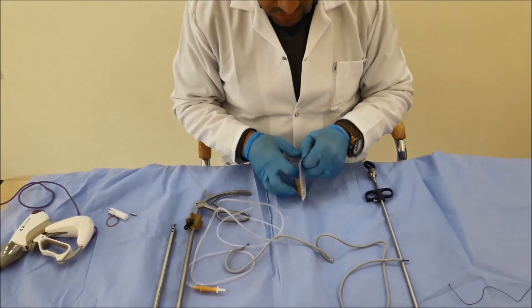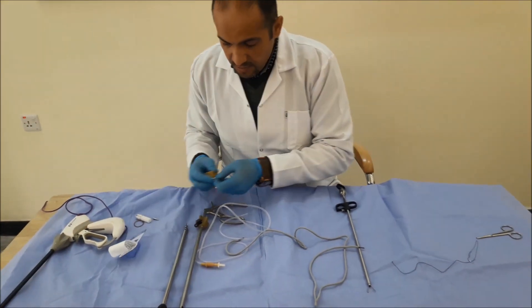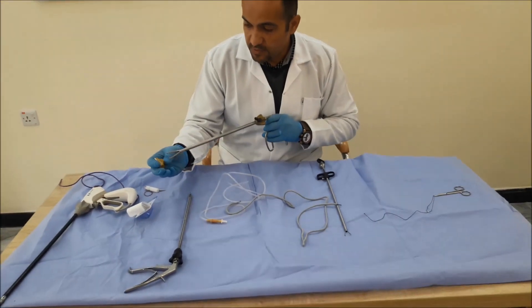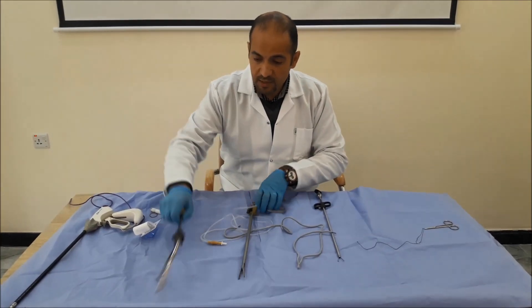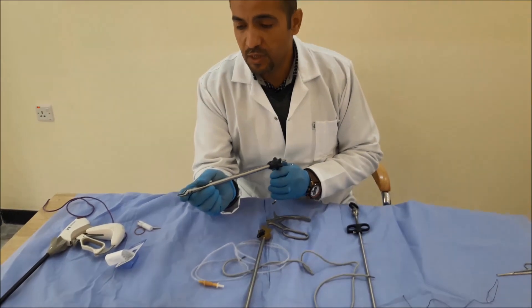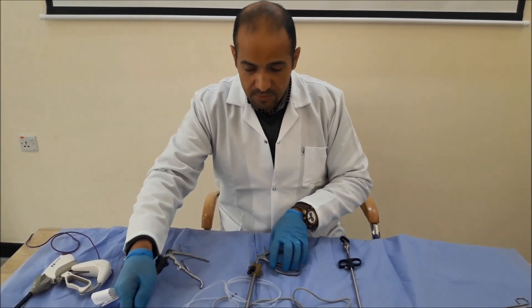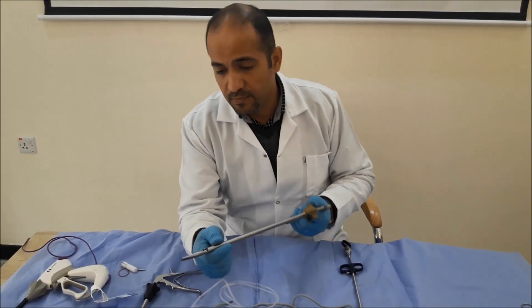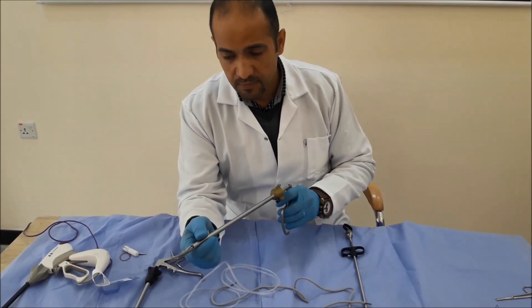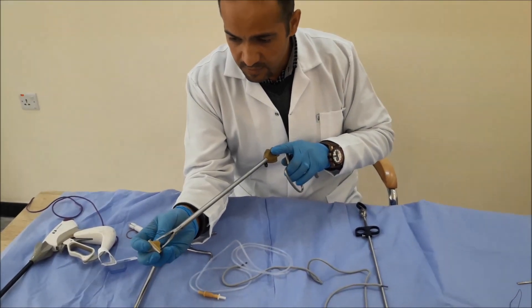Another method is by using the clip applicator — a special size clip applicator. These are the clips, but they are different from another type. The traditional type is used in case of cholecystectomy, or for any bleeding or vessels. But this is a special type for fallopian tube ligation and for ligation of big vessels or other tissue.